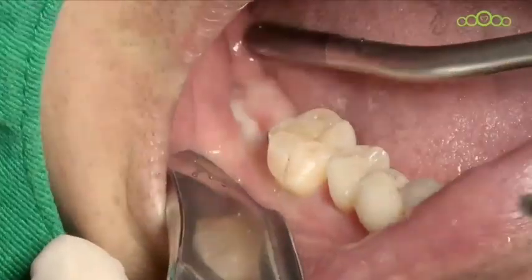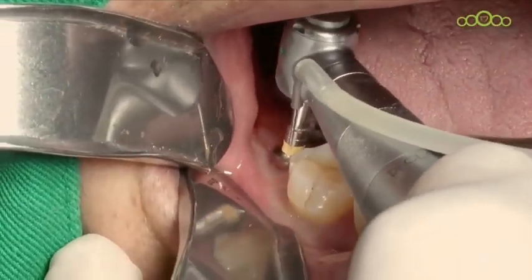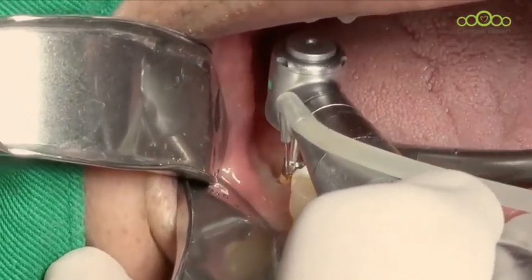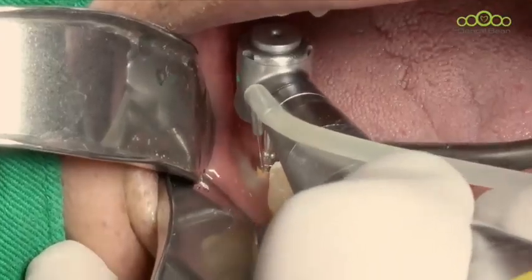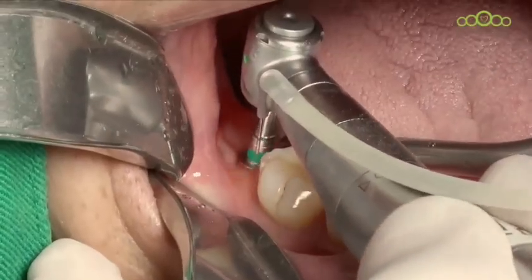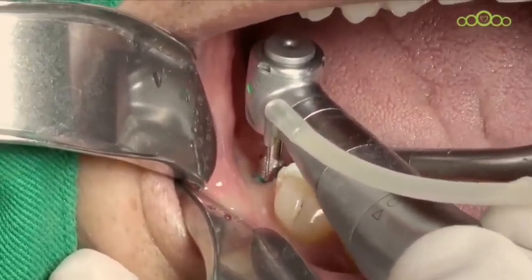Apical bone was relatively hard. Okay, as a routine way, I prepared the osteotomy.